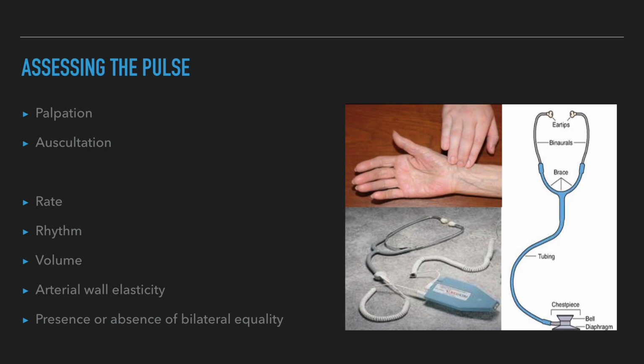Assessing the pulse. Baseline pulse rate and rhythm are established during the initial nursing assessment and are used for comparison with future measurements. A stethoscope and a Doppler ultrasound device may be used to measure pulse rate. Stethoscope. Auscultation of the apical pulse requires a stethoscope. The stethoscope should have snugly fitting earpieces and thick-walled tubing about 12 inches, 30 centimeters, long for optimal sound transmission. The stethoscope should be equipped with a bell and a diaphragm.